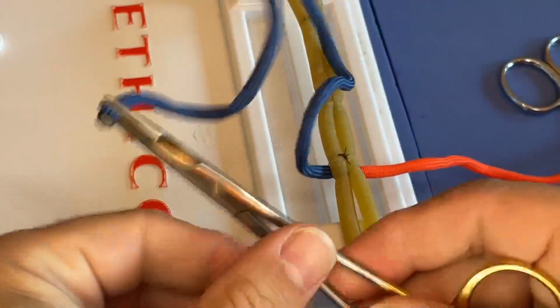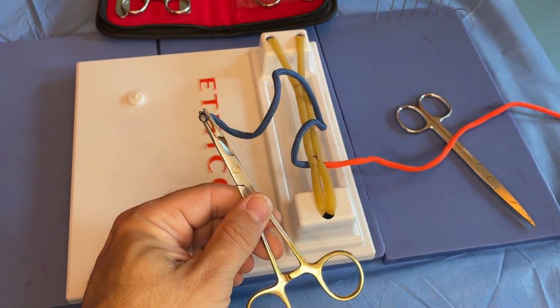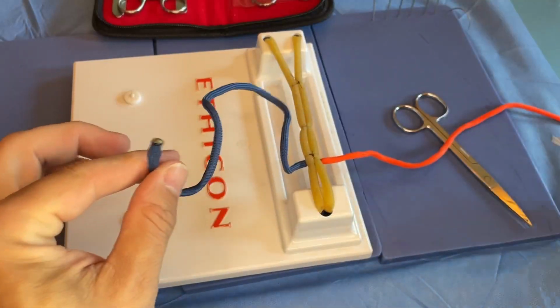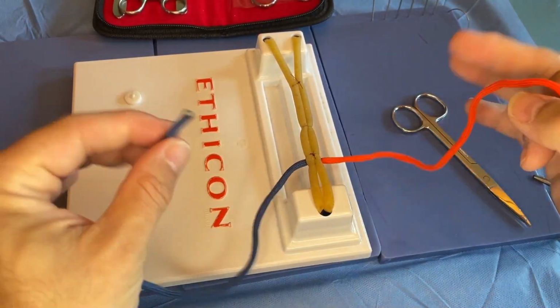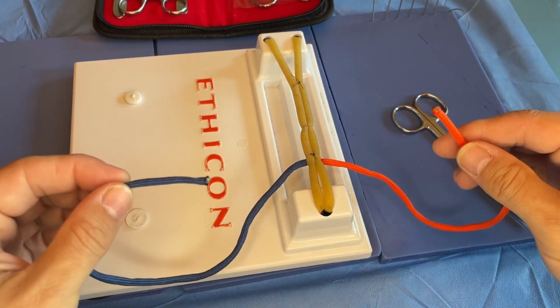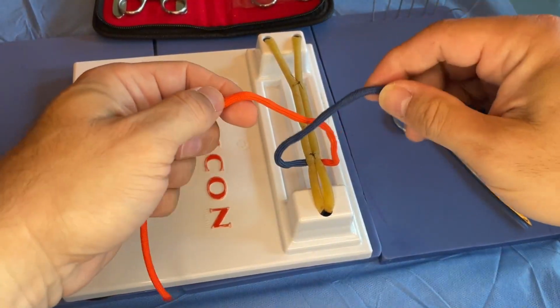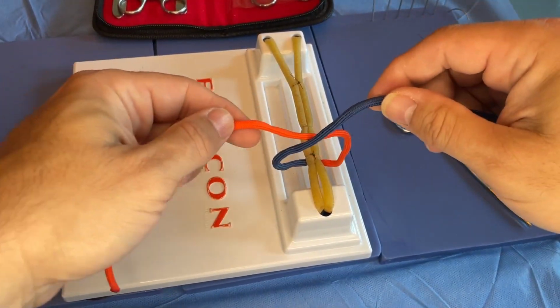Perhaps one of the simplest ways to practice this, and this is how a lot of folks do start off, is, let's say that there's no needle, so we just have a free tie here, and you cross the strands over. So you've already created your loop to start with.